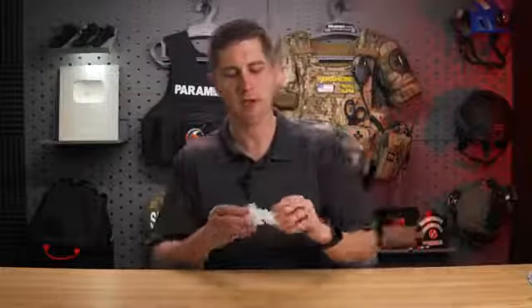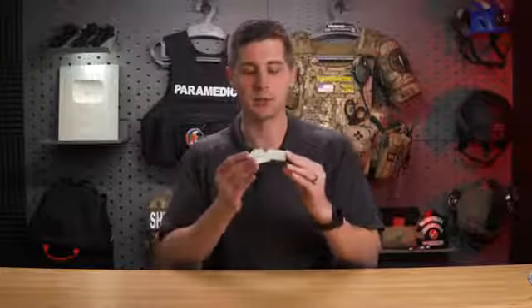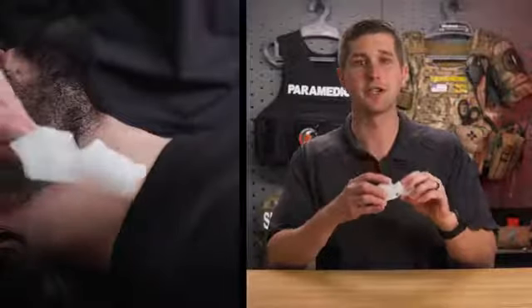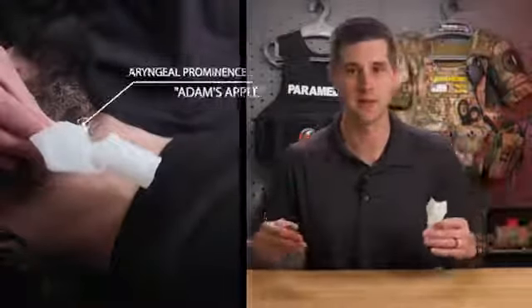So now that we have discussed the indications and contraindications of the surgical cricothyrotomy, we're going to go through some of the anatomy of the neck so you can appropriately identify the landmarks required for this procedure. So right here, I've got a small 3D printed model that has the major landmarks you need to know. The first thing we're going to find is going to be the laryngeal prominence. That's also known as the Adam's apple.